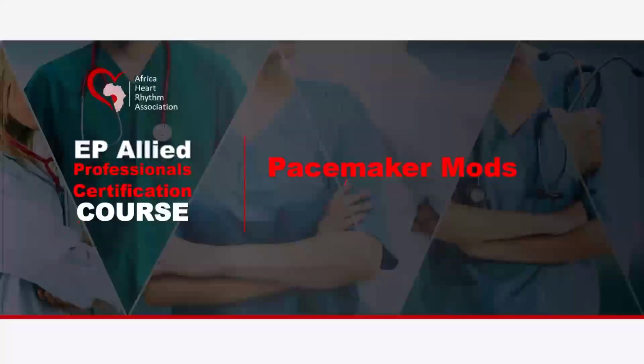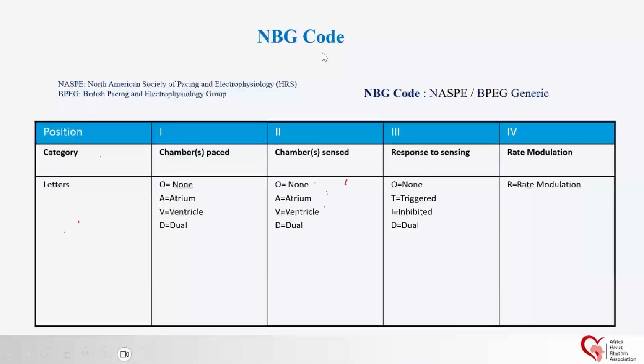So here we will cover the pacemaker mostly, and we have a different code. We can define the mode of the pacemaker. We have 3 letters. Letter 1 means the chamber paced. The second one is the chamber sensed. The third one is the response to sensing, that means if I sense, what the pacemaker does. And the last letter is for rate modulation, or rate response in general.